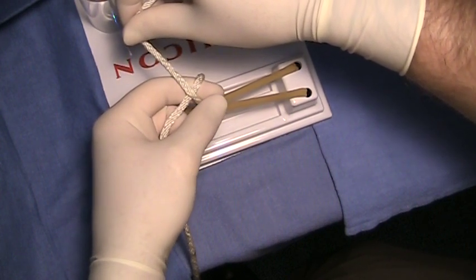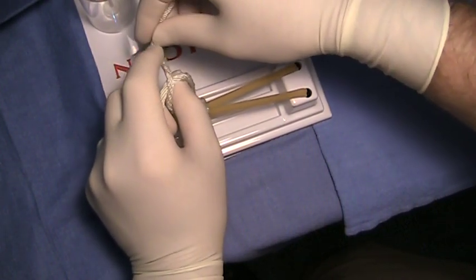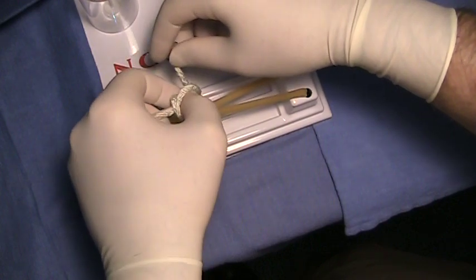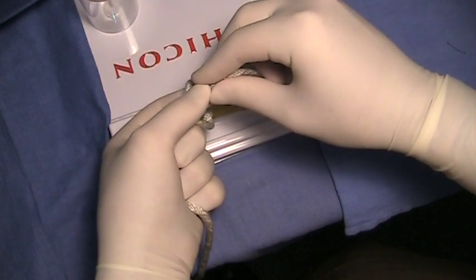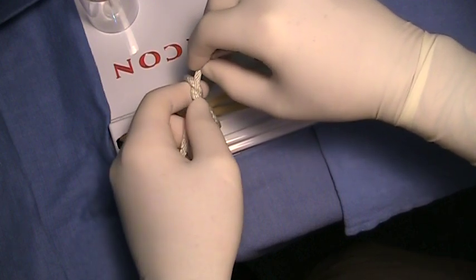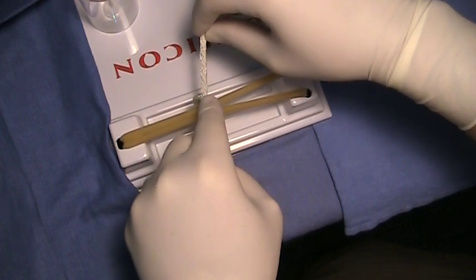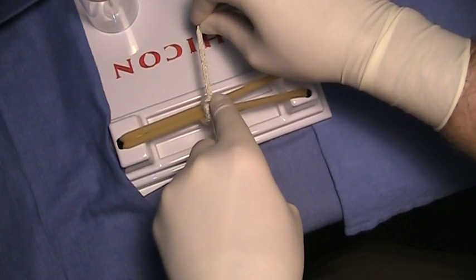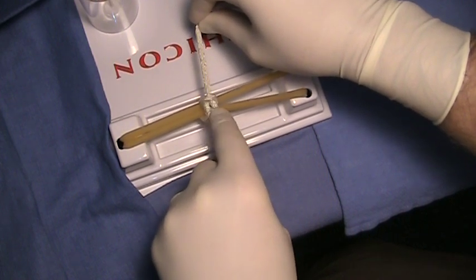You'll pinch your thumb and index finger together, rotate away from you, release, pinch and rotate towards you this time. Re-grab with your right hand the short end, and for the second throw you'll be pulling away from you the short end, using the index finger of your left hand to cinch down and secure your knot.